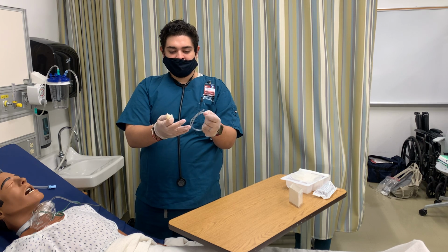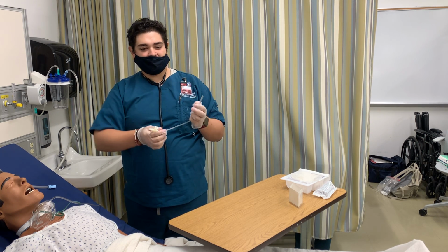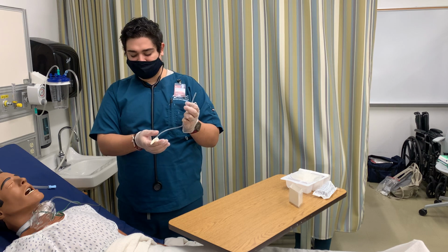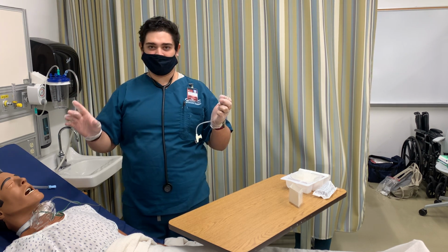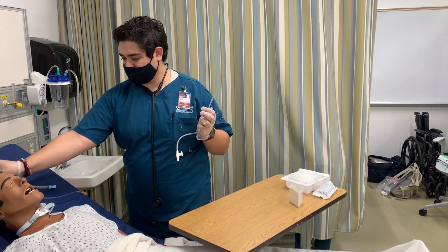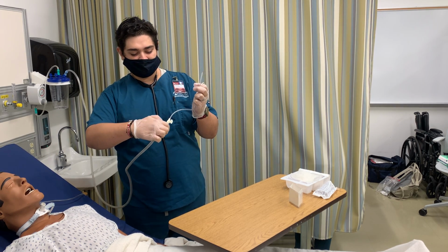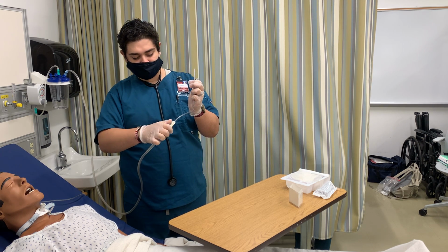I want to keep the suction on my left hand here because I will be using that for mobilization. Now with this hand, I am breaking sterile field. This will no longer be my sterile hand. I will be taking off his oxygen and attaching my suction, making sure, as I did earlier, it is on full suction.